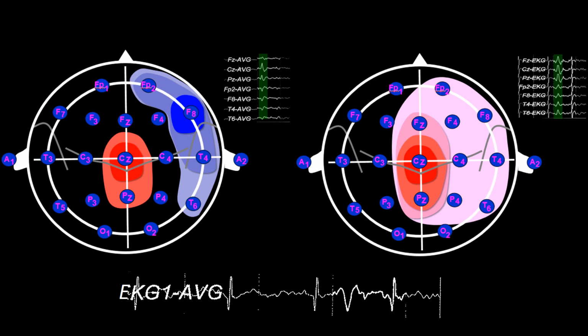The explanation is that the vertex wave entering through input 2 has a much higher amplitude than any other wave entering input 2 at the time. Hence, its contribution to the average reference is disproportional. That is, it's proportionally big when compared with the contribution of the activities from all other channels.